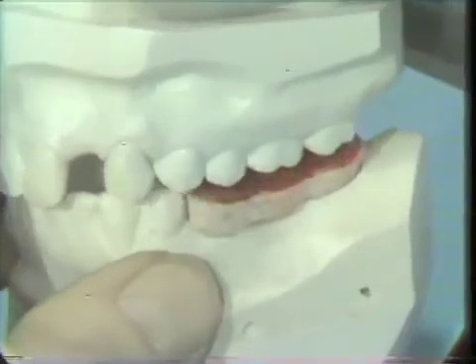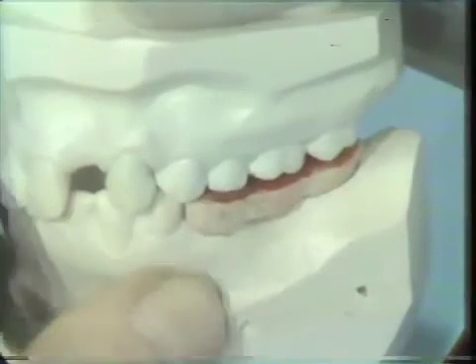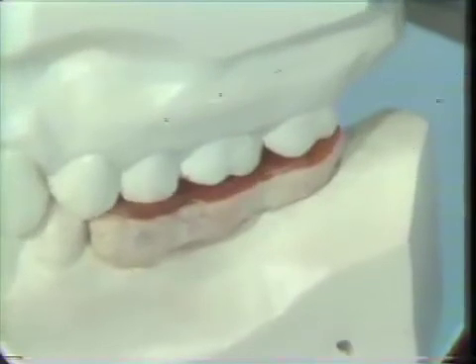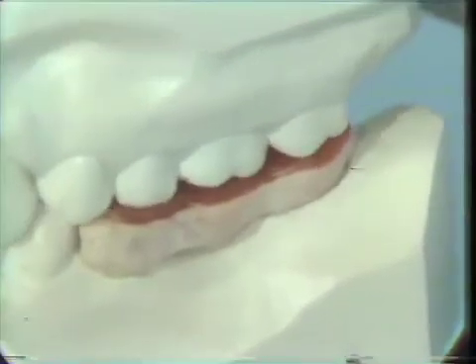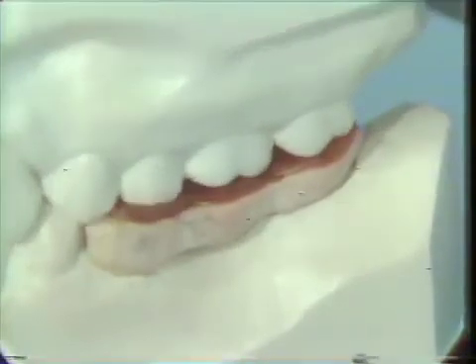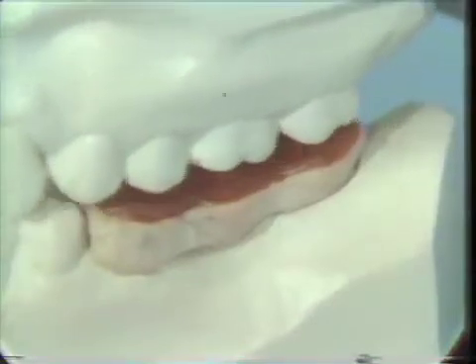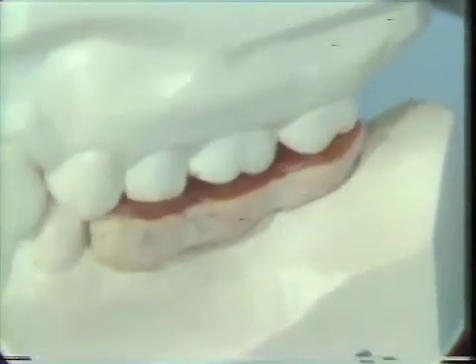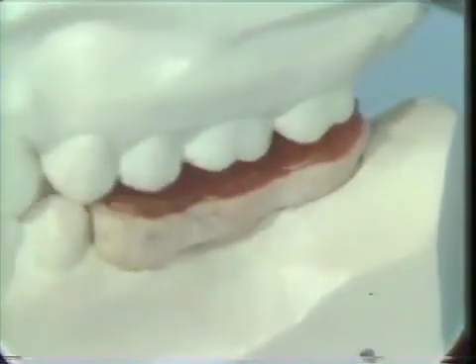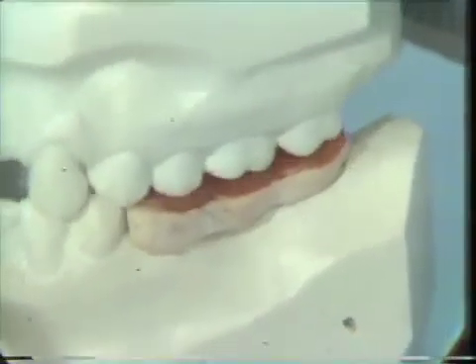chewing in, registering the dynamic movements in a static registration. Now into protrusive, and here you can probably see some of the wax being wiped out of the position that it was set in, and then instruct the patient to chew as if they had a bolus of food in their mouth, so that we might capture any eccentric movements that we didn't capture in our guided lateral and protrusive excursions.